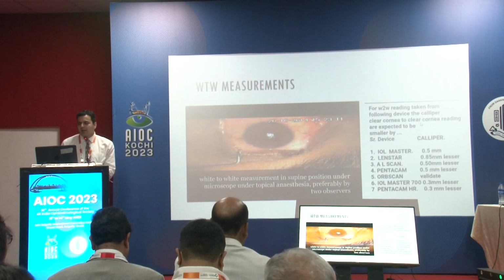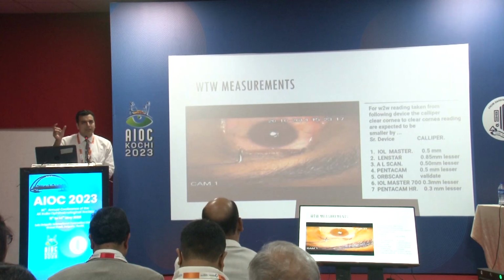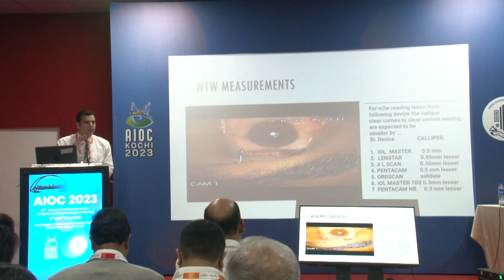We did this recently in around 165 eyes, where we found that the white to white given by the Pentacam was not statistically different from what we were getting using a digital caliper, and that gave us a post-operative vault between 400 and 800 microns.